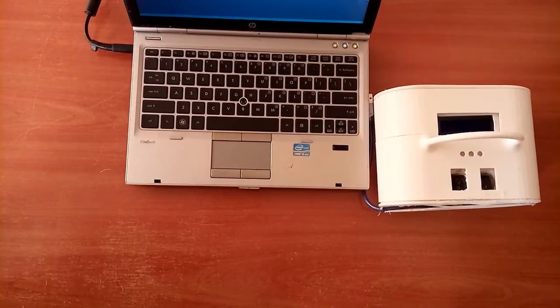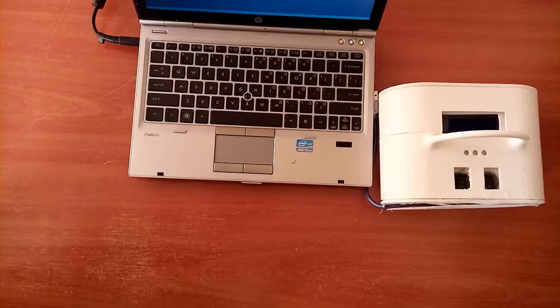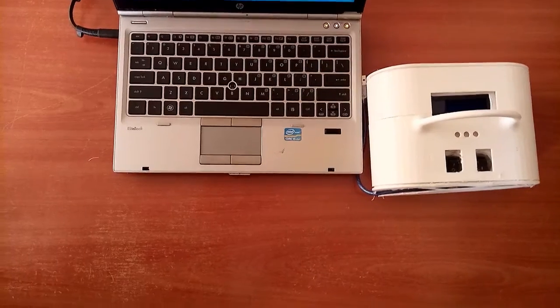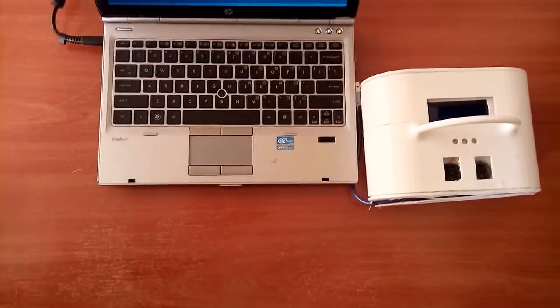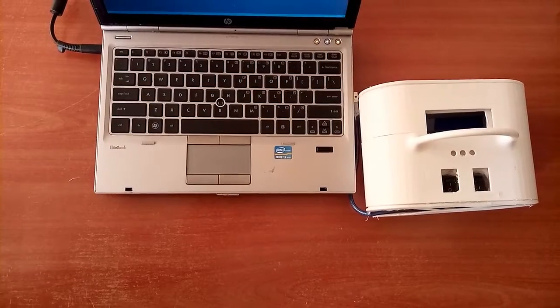So as a contingency plan, we are going to use the Bluetooth module and the serial monitor to show how we are going to track the number of equipment detected, equipment to be used, by detecting different metals and sponges, and displaying on the serial monitor to help the health practitioner to track the number of equipment.